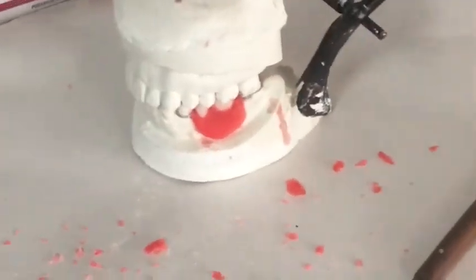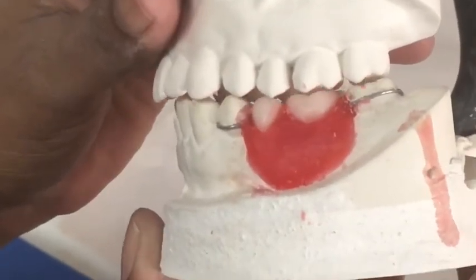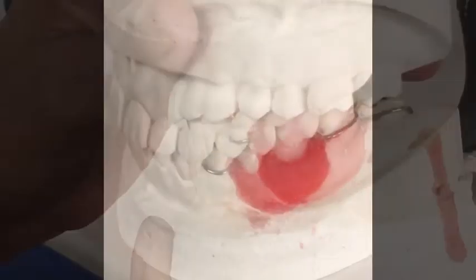After you are done with the finishing, check the occlusion again by opening and closing the articulator, and you are done.